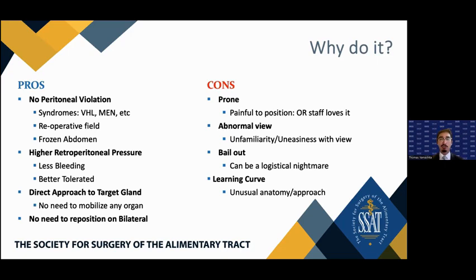So I think the curve for learning the procedure is a little bit longer than the anterior approach because of how our training is. We're not used to having that vision or operating that way. The analogy that I tell the trainees and our fellows is that it's similar to extraperitoneal hernia repair. It's a small space, it's a different view, and the ports are usually fighting each other a little bit. So once you learn how to do it, I think it's a great procedure, but it's many times not the most ergonomic procedure to see someone do.